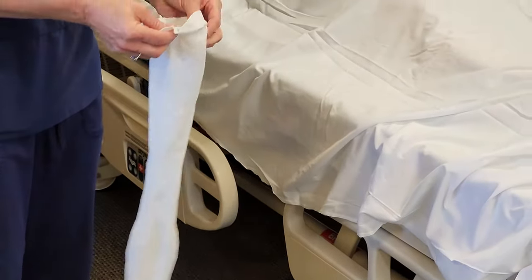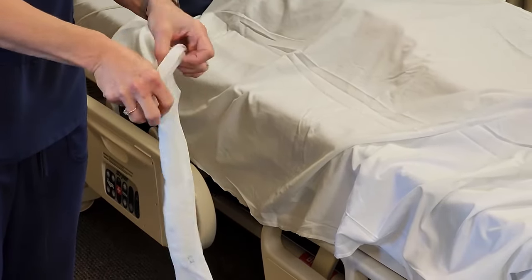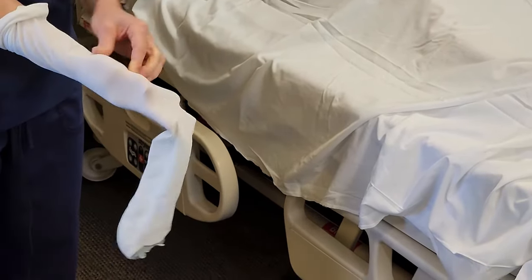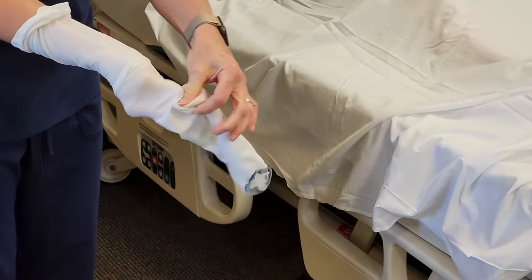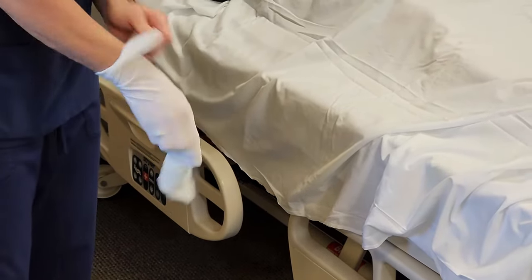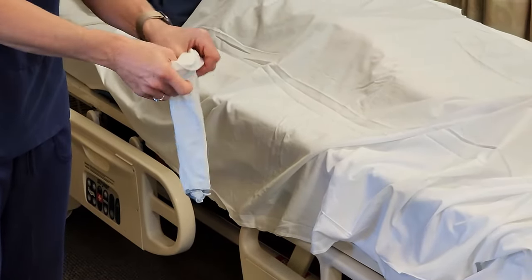To put the Ted hose on, you can either roll down the top, gather it, or turn the Ted hose inside out. For any of those methods, find the heel marker. If you turn it inside out, pinch that with your fingers and turn it inside out that way. I'm going to choose to gather the sides of the Ted hose down to the heel.